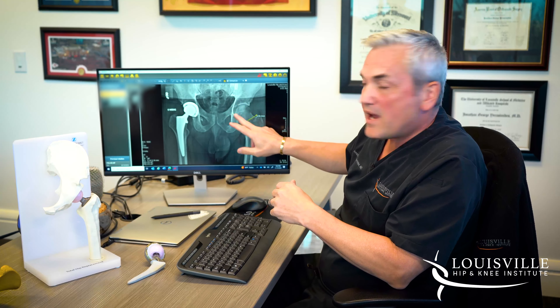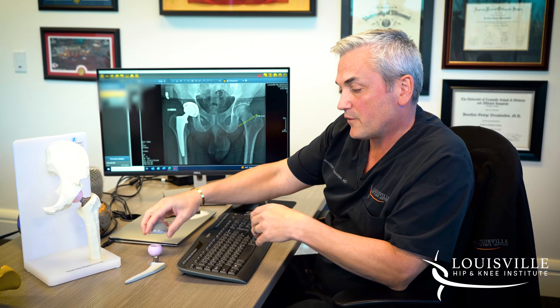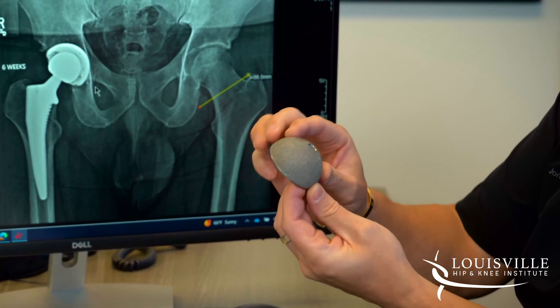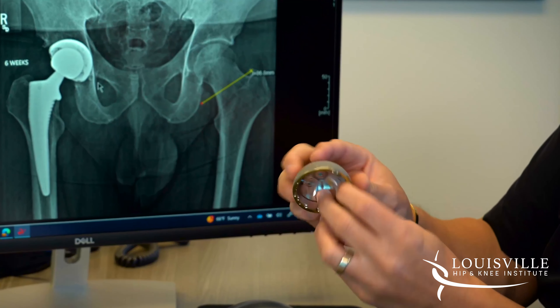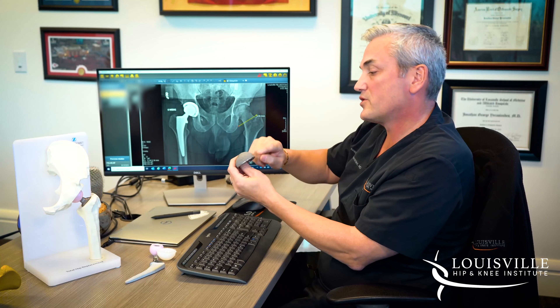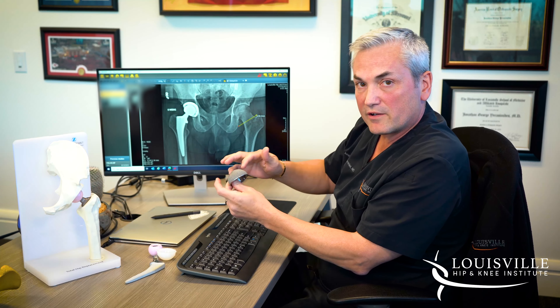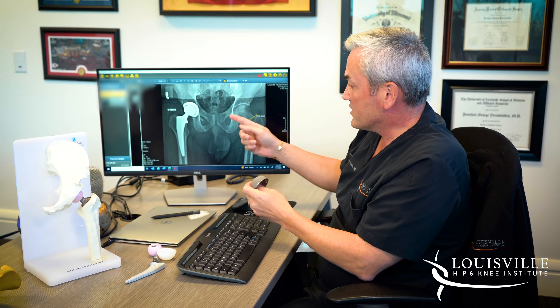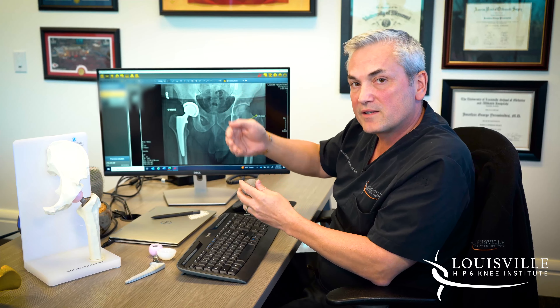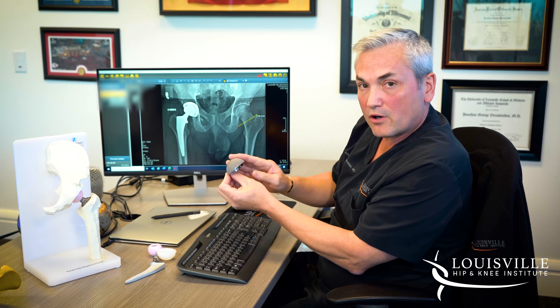Now we have to make this socket into a shape that's going to fit our artificial implant. This is an example of what we call a cup — an acetabular cup. We have a tool called a reamer, which is shaped like a hemisphere and looks somewhat like a cheese grater on the outside. It spins on a drill in order to make the inside of your socket a perfect hemisphere, ready to receive the artificial cup.